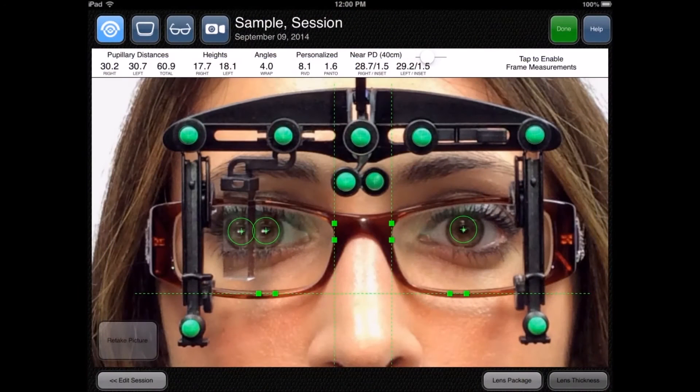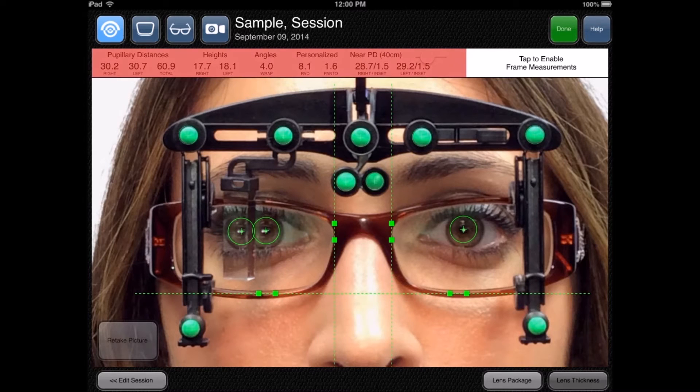Once a proper picture is taken, the measurement picture is displayed. Now you have all of the measurements needed to order your lenses.